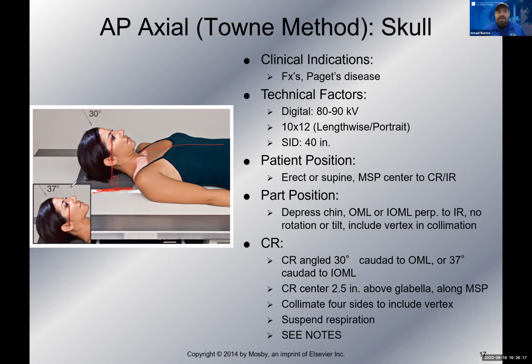So if we have the OML perpendicular like we have in the big picture there, we need to angle our CR 30 degrees caudad to that OML, right? So if I was to extend this OML up, right, the angle between that CR and that OML is 30 degrees.